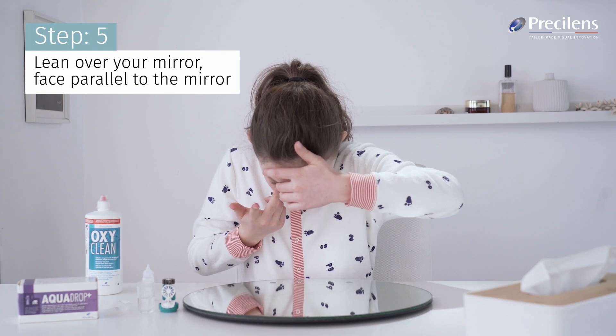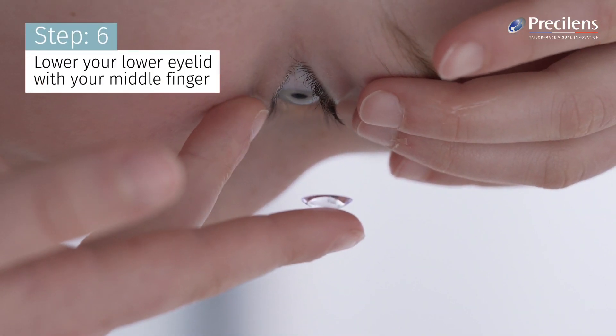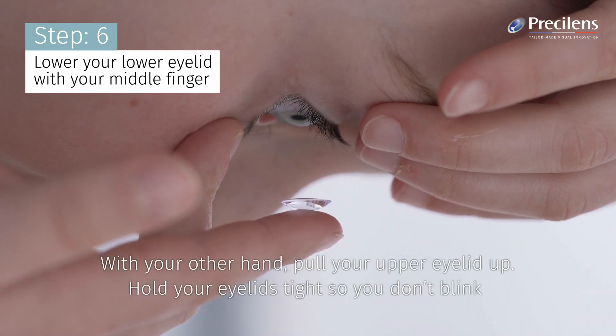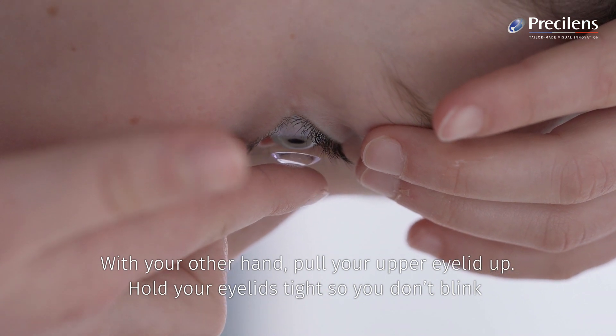Lean over your mirror, face parallel to the mirror. Lower your lower eyelid with your middle finger. With your other hand, pull your upper eyelid up. Hold your eyelids tight so you don't blink.